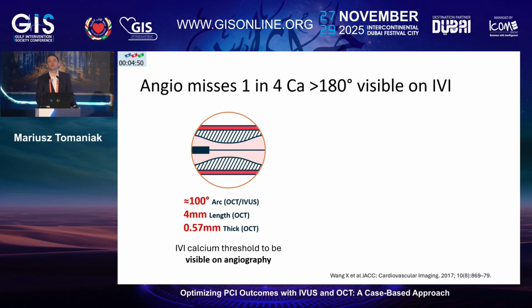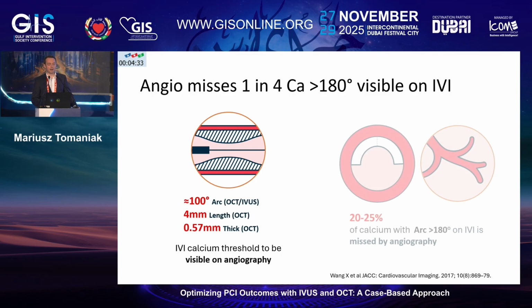Can we do it only based on angiography? Naturally it is doable, but we have to realize that we are not serving our patient in the best way, and that we have both imaging and device modalities available that can help us improve the long-term outcomes of PCI.